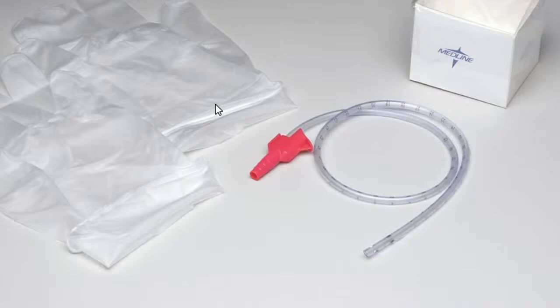So this one you can connect to the suction line, and then you can suction the mouth, the nose, and the throat. If you are required to suction the mouth and the nose, you should never suction the mouth first.